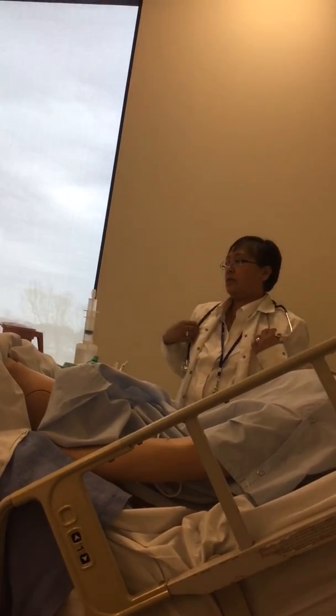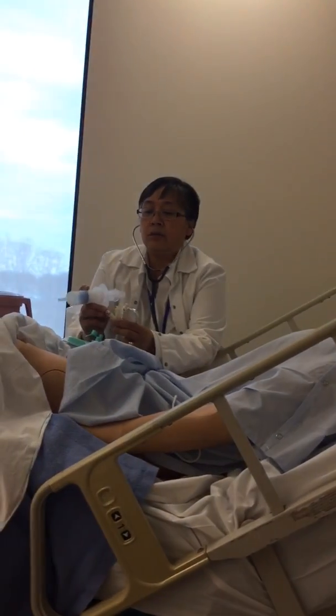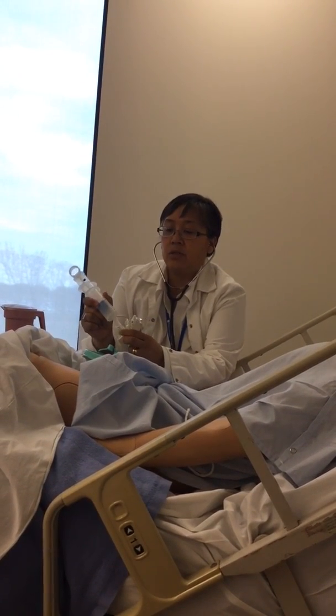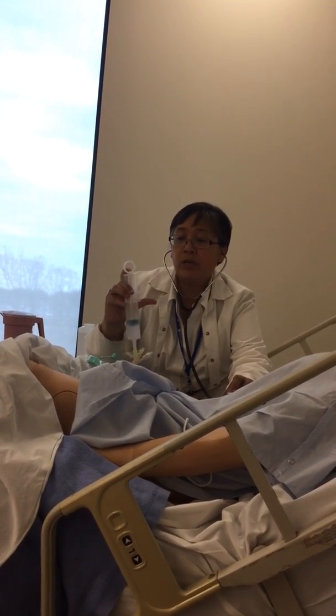Yeah. 30 cc's of air. I'm going to take my stethoscope. I'm going to listen in the patient's stomach. I'm going to take the little notch there, and I'm going to put my syringe on. And I'm going to inject air in pretty quick.